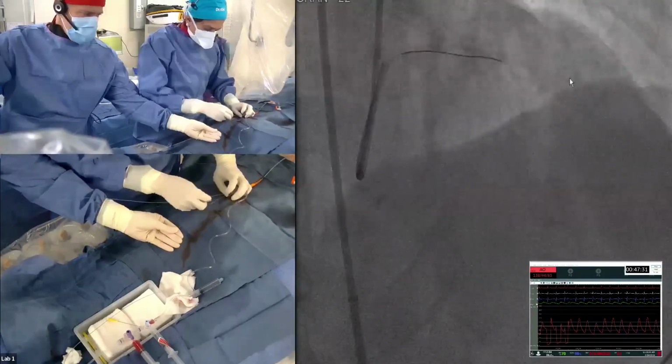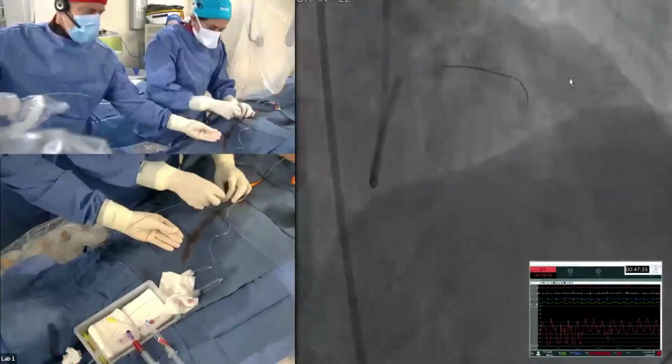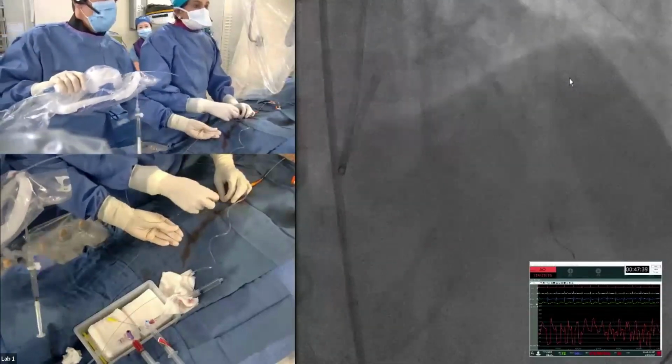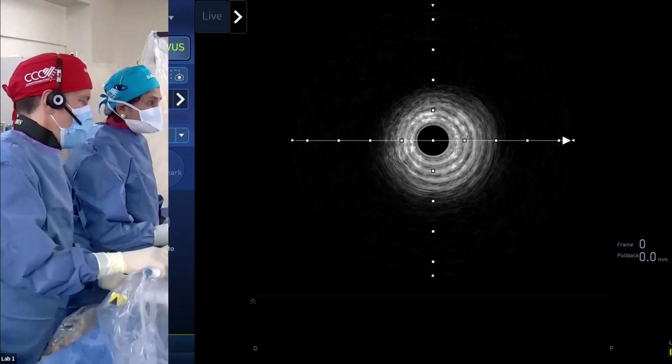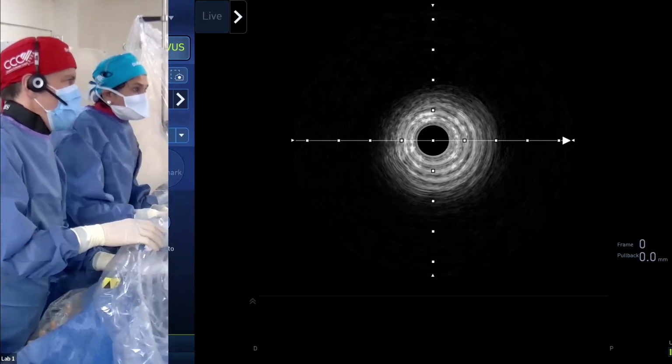Both options are available. And then also try to treat it with, I will say, probably a two-stent strategy. But in India, many times what I do is, after the decalcification, I place a stent in the main artery, and if there is no dissection, DEB to the side branch.